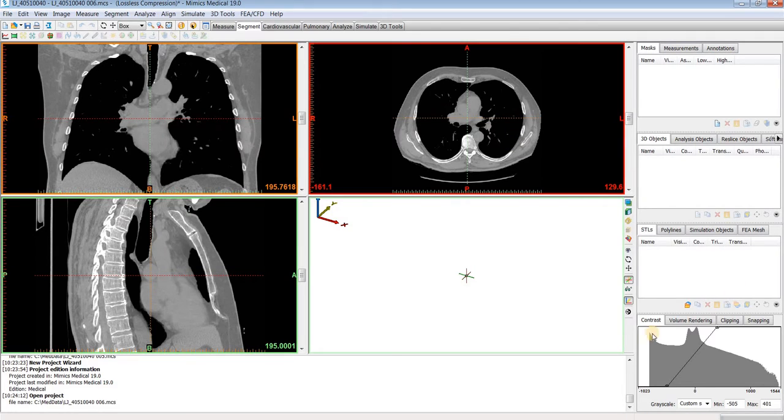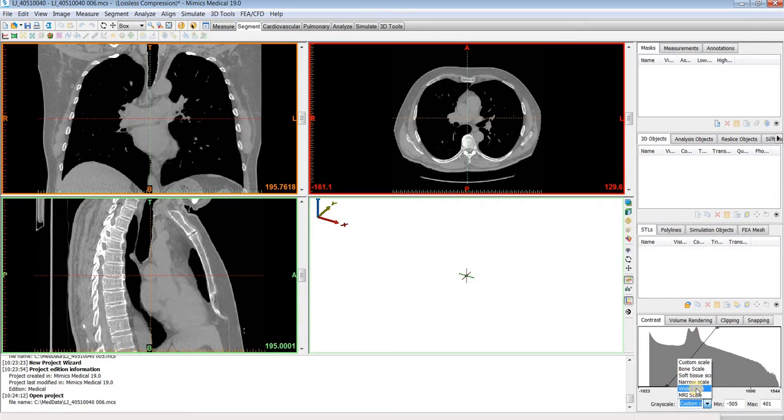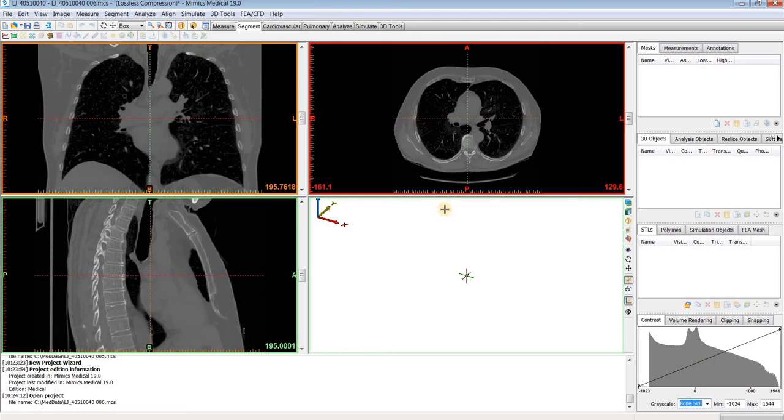There's also some predefined sets for CT scans, so if you're going to be segmenting out bones, you can just choose the bone scale, same for soft tissue and the like.